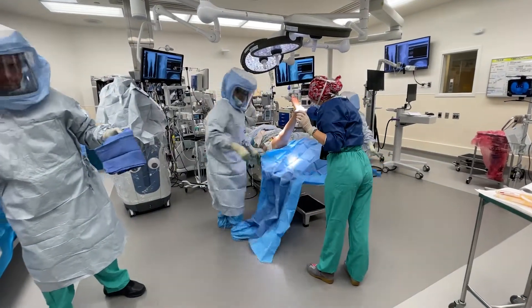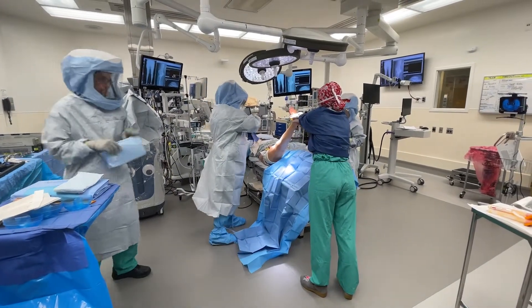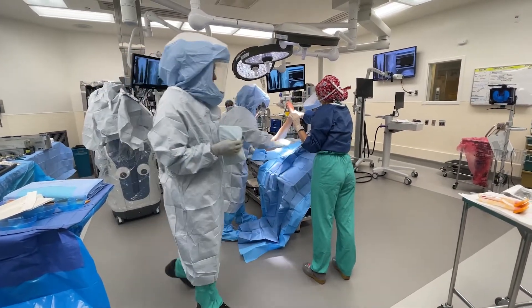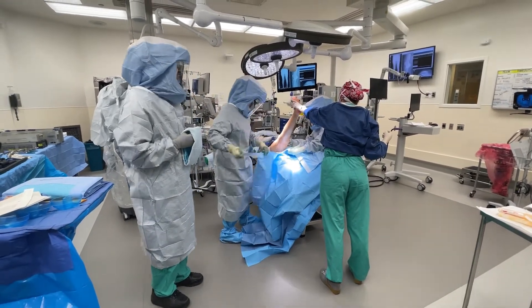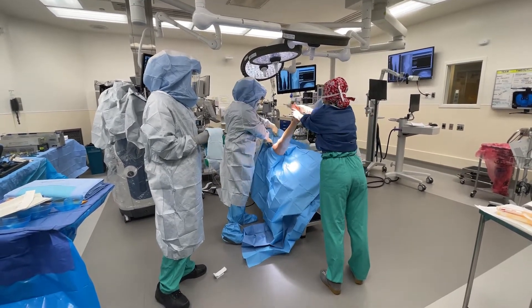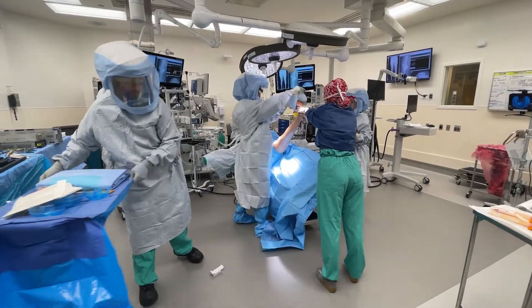I start off with a brown sheet and use a blue towel over the nail block as a reminder for when we're taking the clips off. Then I use a plastic impervious u-drape and make a tight seal at the proximal end. This is followed by the impervious leg bag.